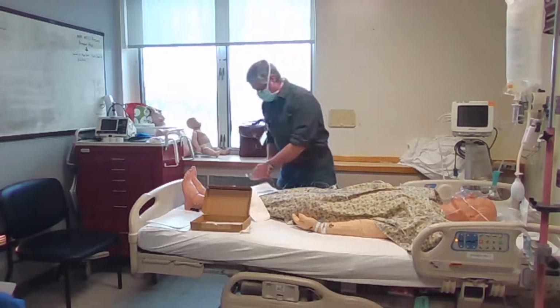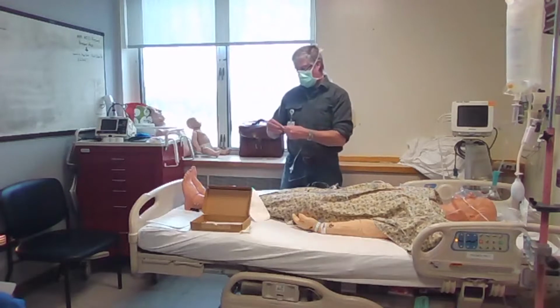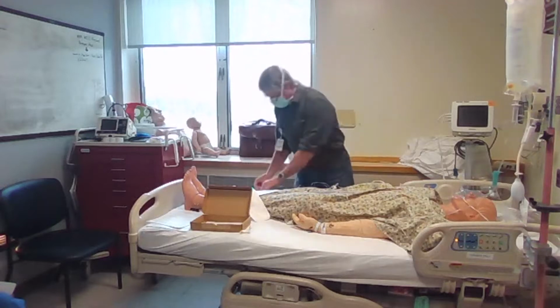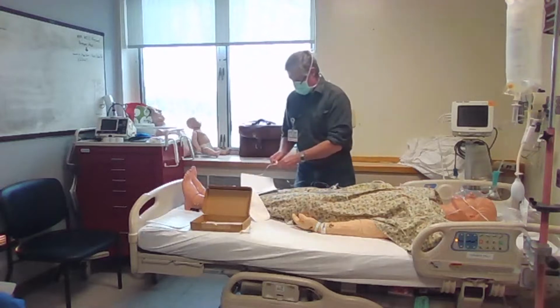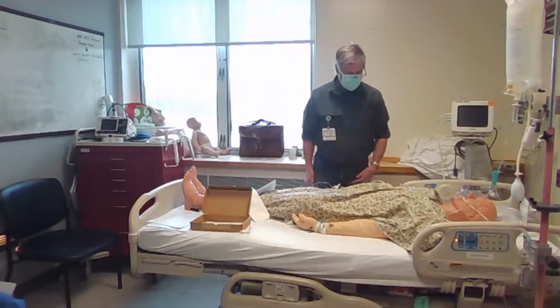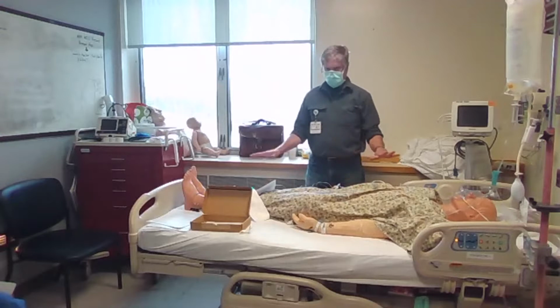So if you want to, a lot of times you'll just leave that one on the end that's going to go to the patient, just because you'll pull it off right when you put it to the patient. But the other two important ones are the stopcocks, because you'll end up getting blood in the line too, and it just becomes really messy and an infection risk. Okay, any questions about that?